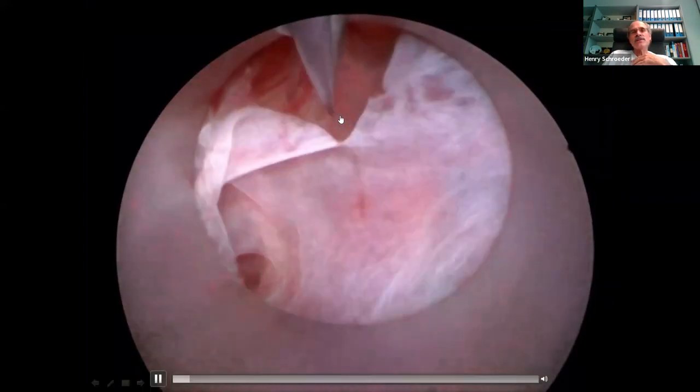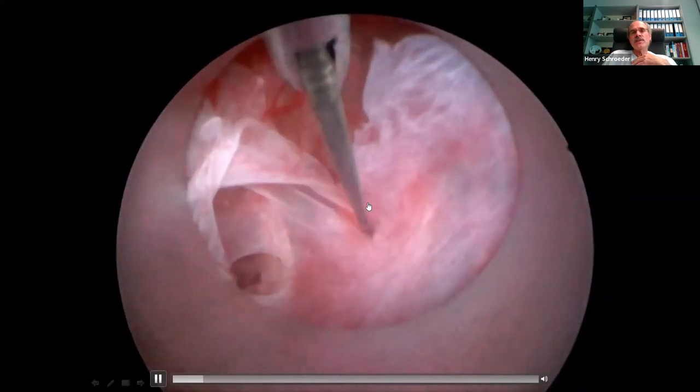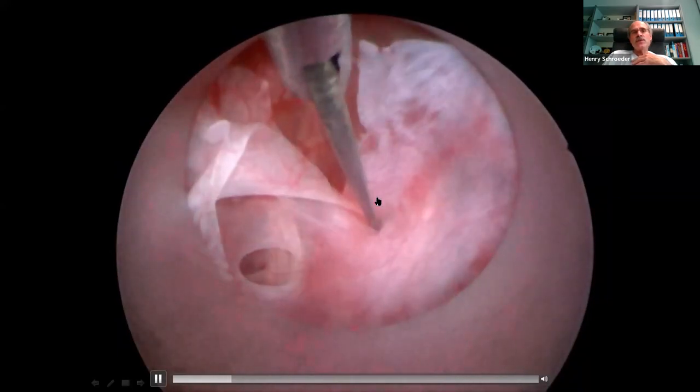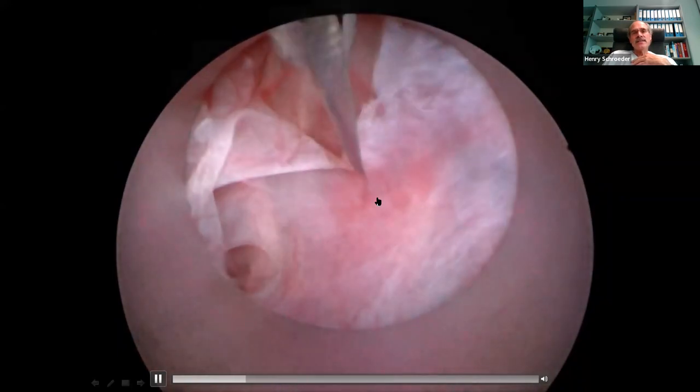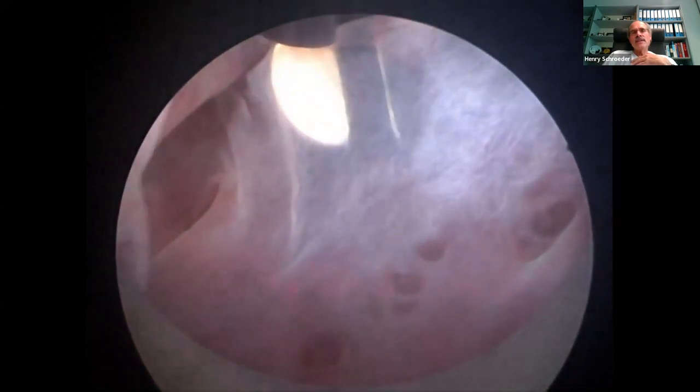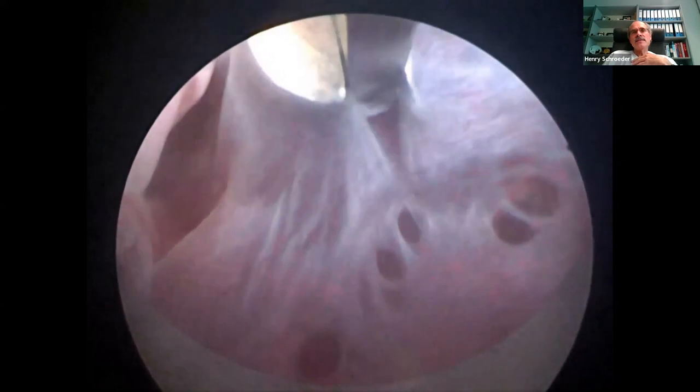You see, this is a regular scissors. There is an artery below this membrane, and the tip of the blade always goes to this artery. So it's a risk, I cut it. With the guillotine knife, I can go under the membrane, elevate the membrane, and then come down with my blade and cut it without the risk that I damage the artery, which is running under this membrane.